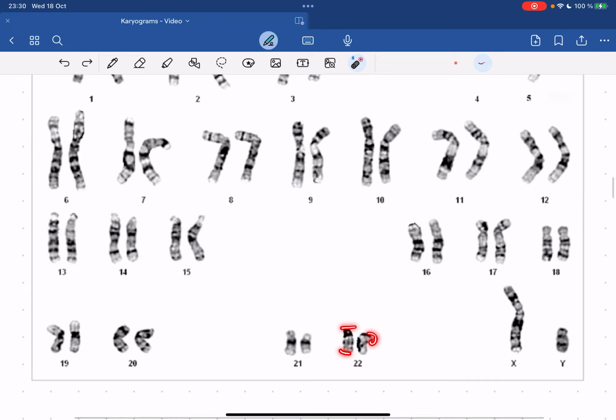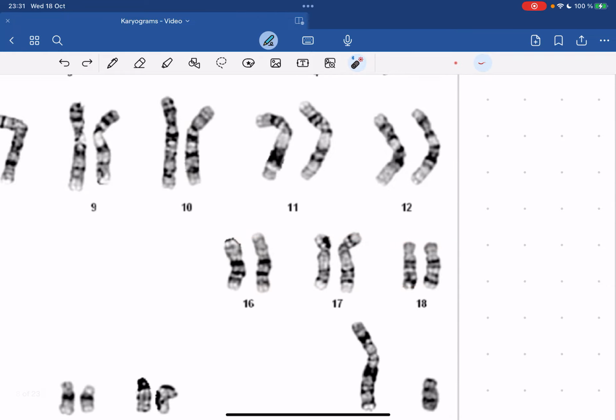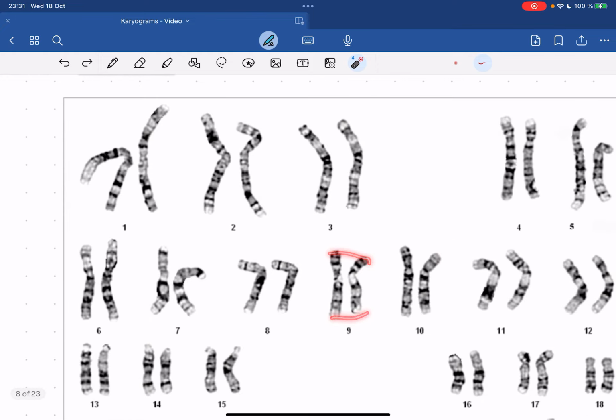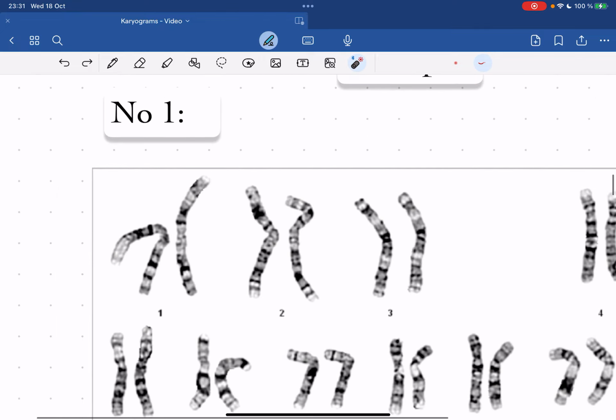These 2 seem equal length. These 2 kind of seem equal length, not really that sure. These 2 do seem equal. All 3 of these seem equal to each other, not in comparison from this to this, but to each other they seem equal, right? This one looks a little bit wonky, but we're not that sure. This one looks pretty equal. This one, even though it's kind of bendy, looks pretty equal. This one looks a little bit like it's losing something there, but we're not that sure. We'll see for any more obvious examples.